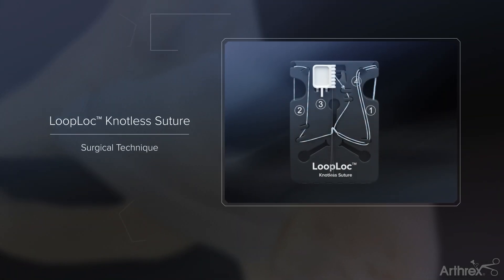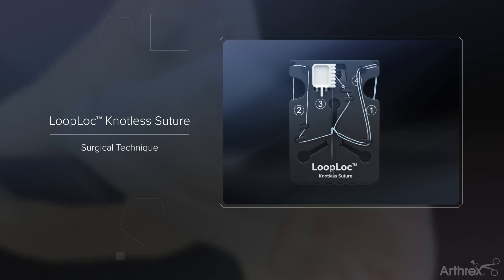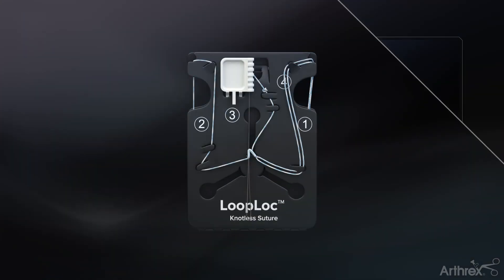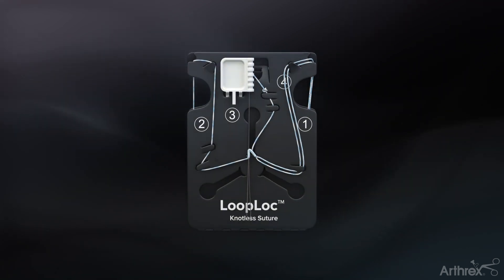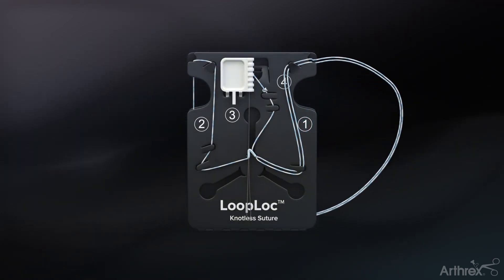Arthroscopic closure of the hip capsule using the loop-lock knotless suture. Unwind the fiberlink passing suture by pulling the suture from the suture management card labeled number one until the suture tail is exposed.